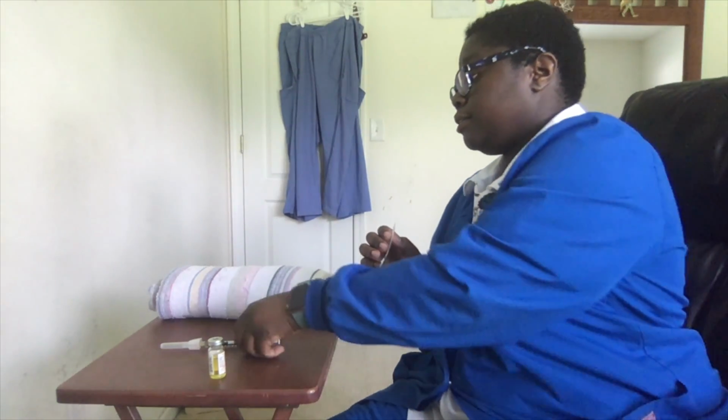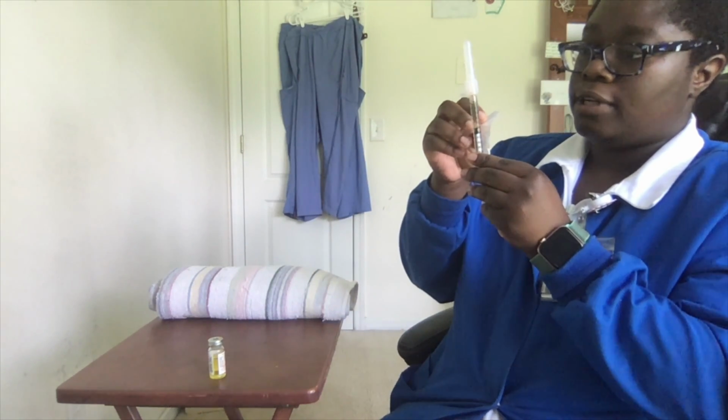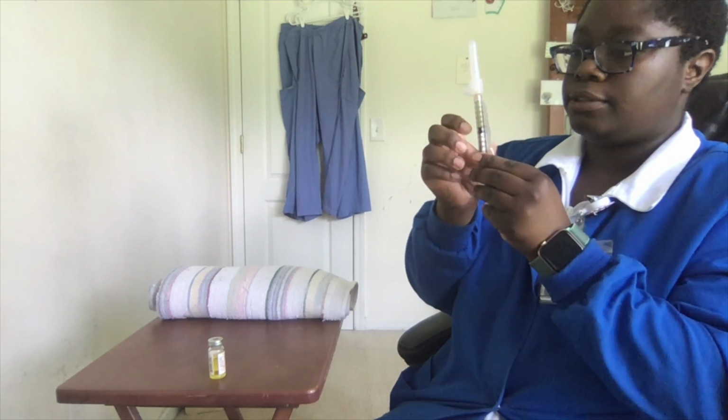Now that I have my medication ready, I'm going to take a medication barcode and place it on the actual injection, being careful not to cover any of the numbers.